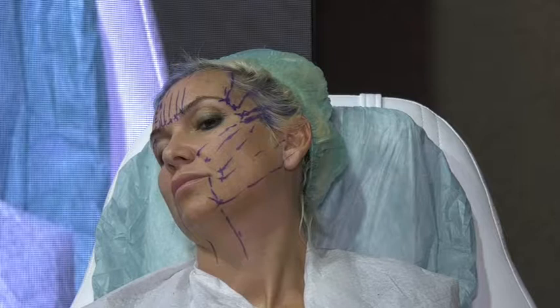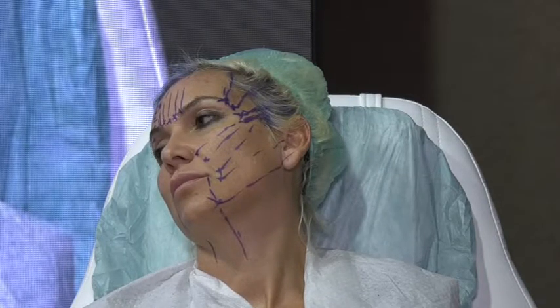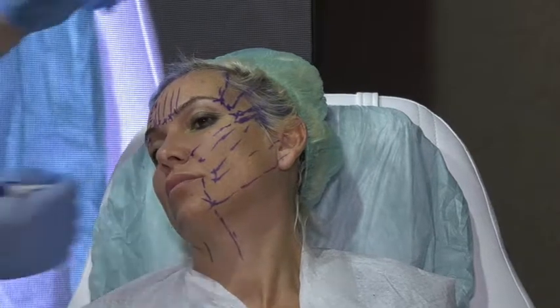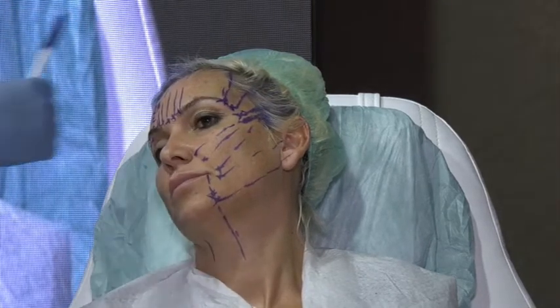You will not need to pull this area up and move all the way around, and when she talks and eats, you will feel the thread move. No, you work anatomically. This is the jawline. I should not do the jawline like that. Okay? So now I finish the jawline. I finish this zone. 2 threads is enough. If I want to add one more, I can add one more, either to the marionette or just above this one. I can add another one here if I want. Like that.